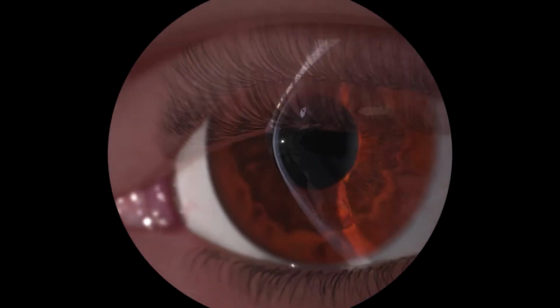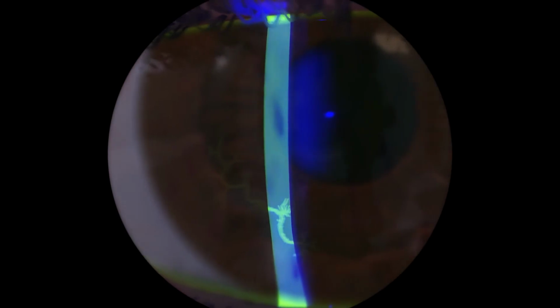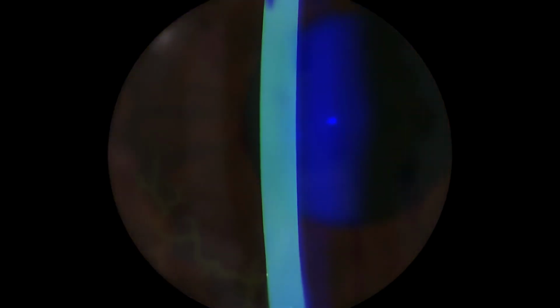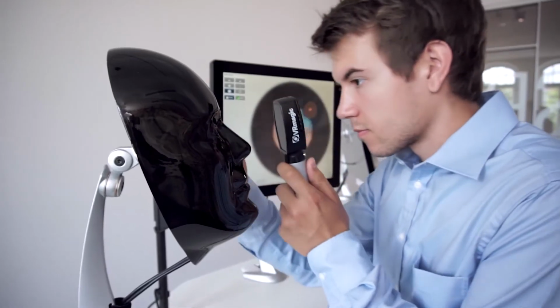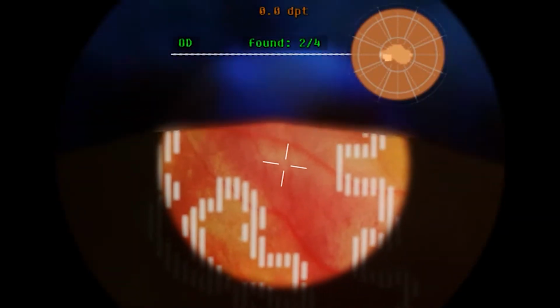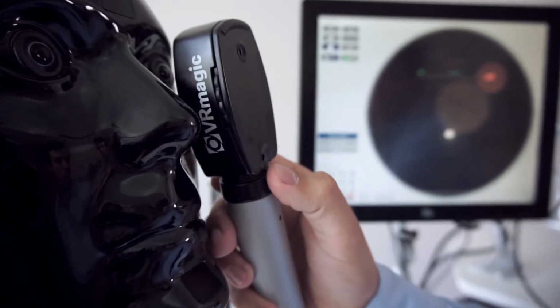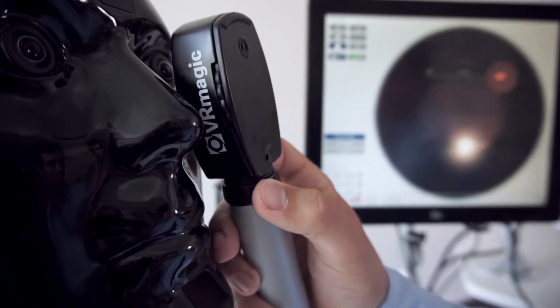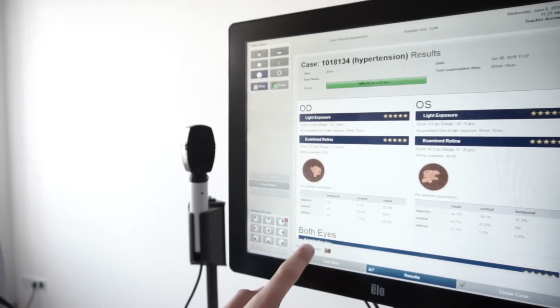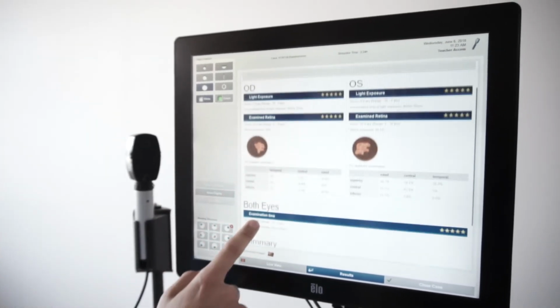High-end simulation of patient eyes allows for a highly immersive training experience. IC simulators offer a lifelike training environment with true to original devices. All IC simulators offer an embedded curriculum and detailed evaluation of the trainee's performance.